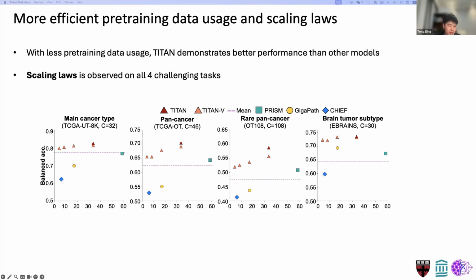Because all of these patch embedding models produce very different embedding spaces, maybe a possible approach is to train a projector that projects one model's embedding space to the embedding space that Titan requires. And hopefully that training is light and affordable, on a very small amount of data and not much compute resource. Yeah, it would be nice to see how it works.